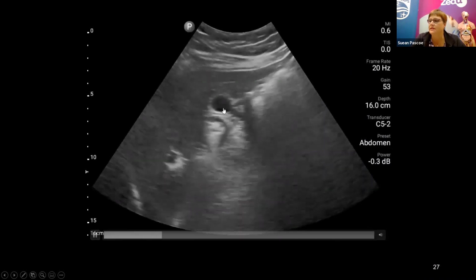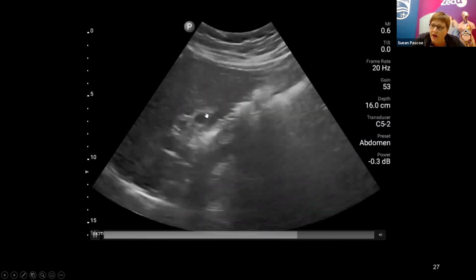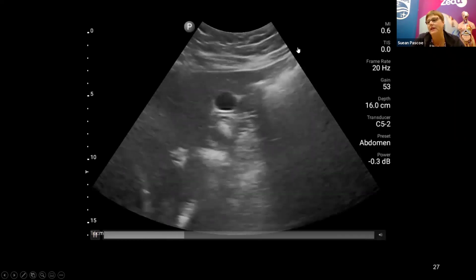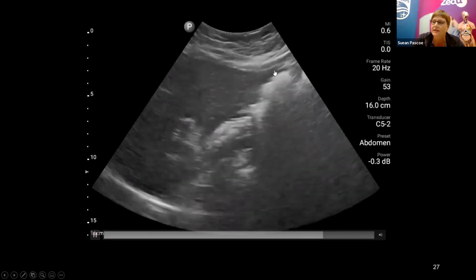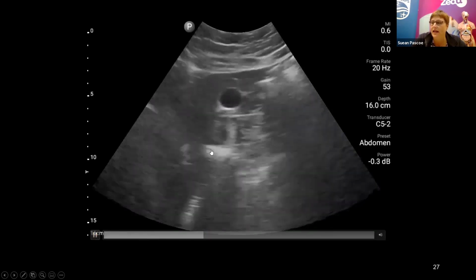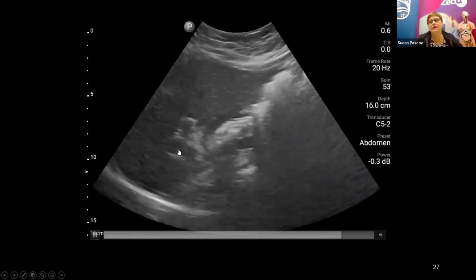This one. So see here, that's what I thought at first, as it comes up, that's what I thought at first was the portal vein. But then as you scan around, you can see that that's tracking up towards the surface, superficially, and is clearly linked to the gallbladder. And we then see this bit of bowel, and deep to that is the portal vein, just over here.